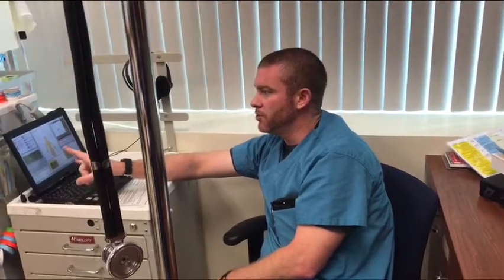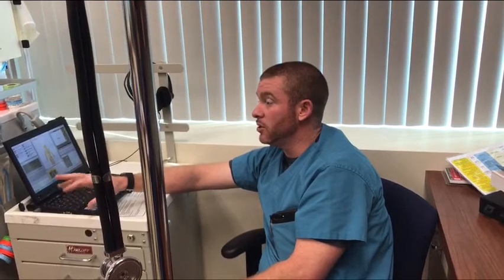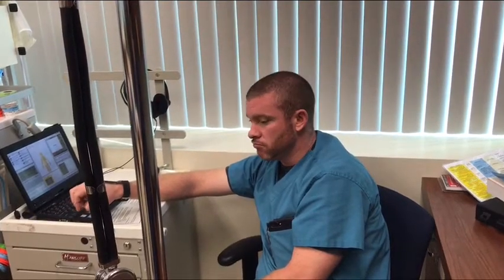You're on a Mac gas 2.0 sevo. He's already had his antiemetics, Decadron 10. I gave a little bit of Reglan just because of the RSI. I haven't given him anything else. He's had 150 of fentanyl, 200 of propofol, 150 of succinylcholine, lidocaine 100, and 2 of Versed. Antibiotics, he got 2 grams of Ancef before we came back. That's in. What else can I tell you?